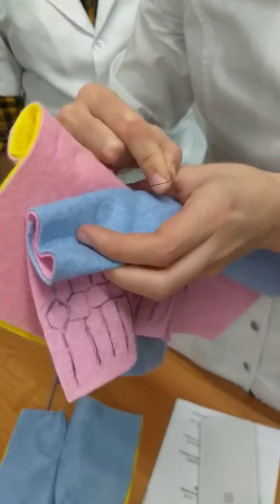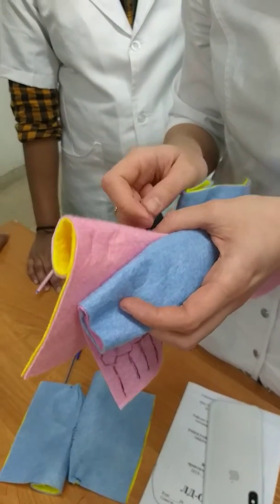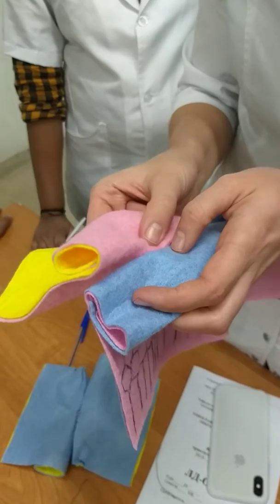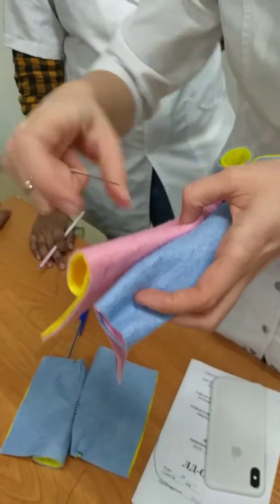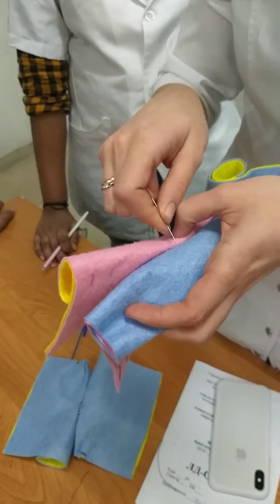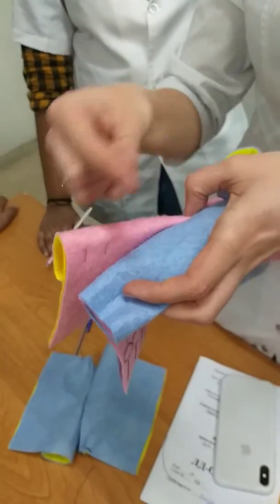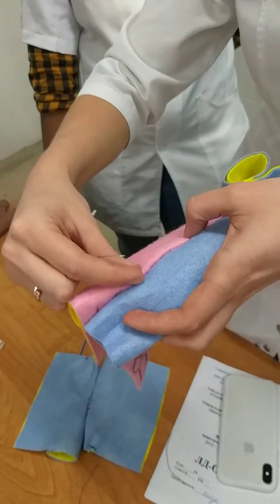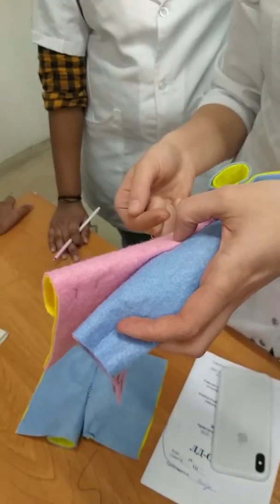For example, interrupted or non-interrupted, make a layer of suture. After that, make one more layer, the second layer, so the inner layer of suturing. After that, dissect the intestine space, and here you have the anterior wall, and make the inner layer of the anterior wall and the superficial layer of the anterior wall.